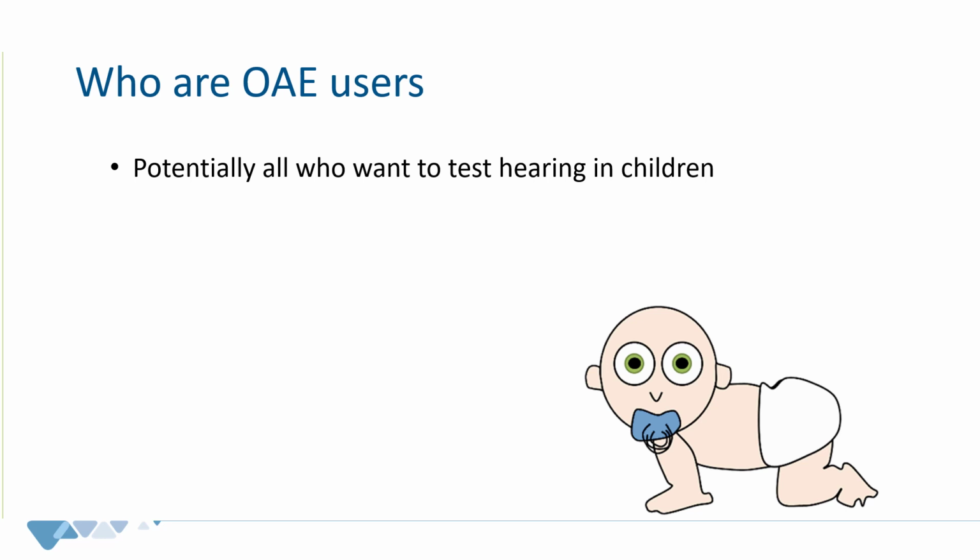And they might say, well, why? Well, because it's a perfect tool to prove that the hearing is normal. And it is so quick and easy. It takes away a lot of doubt if it's otherwise difficult to say something about the hearing. So in my opinion, it's not just newborns. It's not just newborn screening.